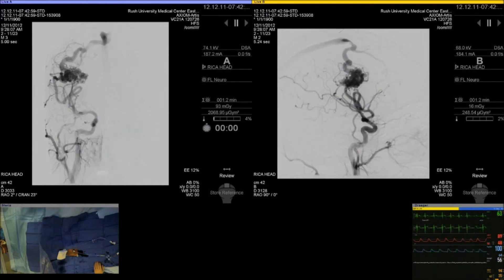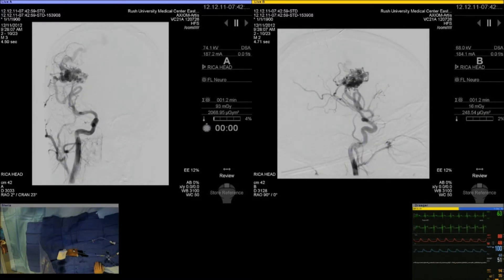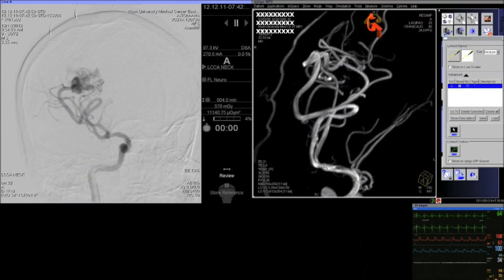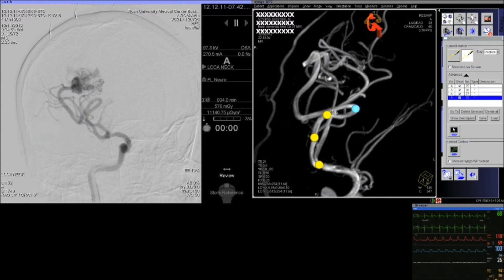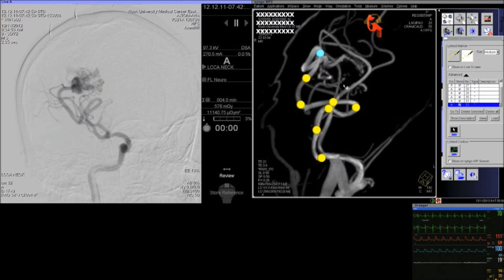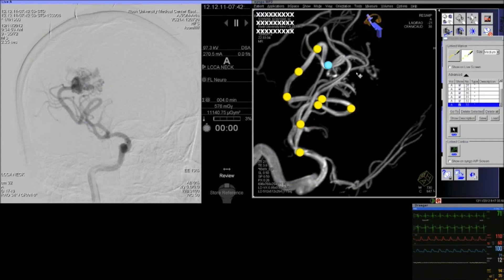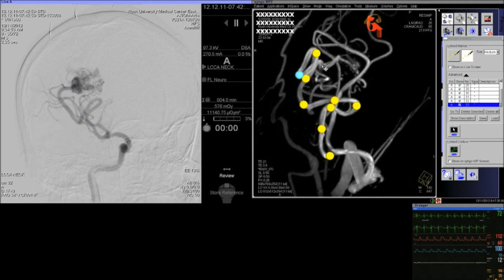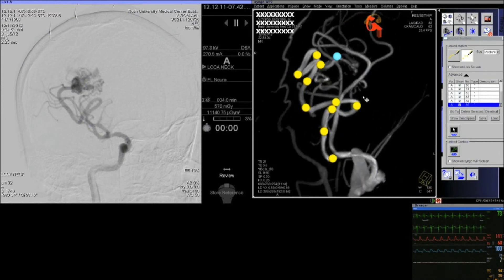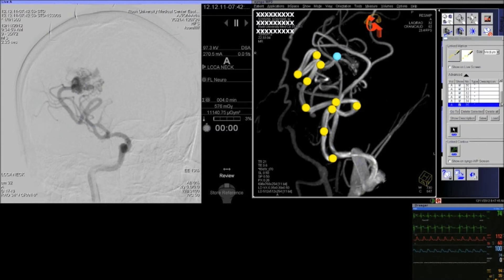We then decided to establish a pathway to the AVM, and this is something that I think is very important because the morbidity of embolization a lot of times comes from access. Having a mapping of your trajectory so that you avoid too many catheterizations of vessels and passages is quite helpful. You do a 3D spin and then use your toolbox to select a pathway to where your vessel of interest is.